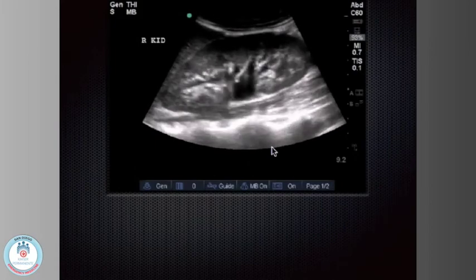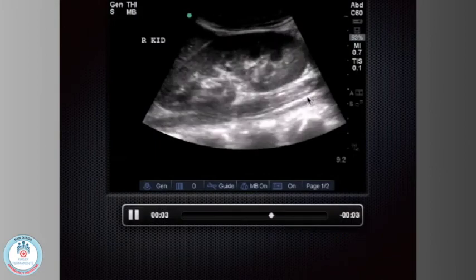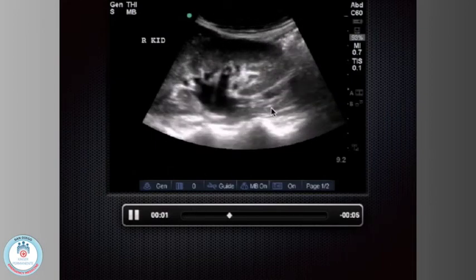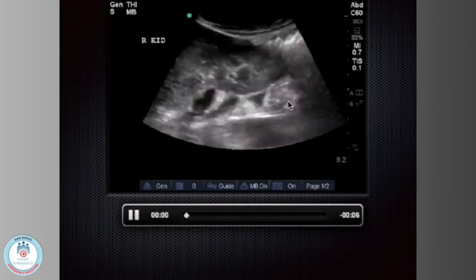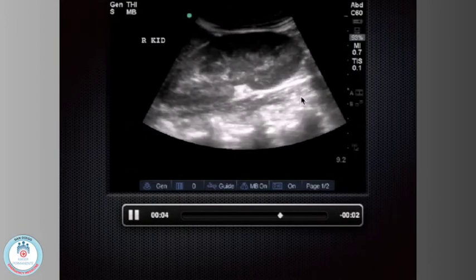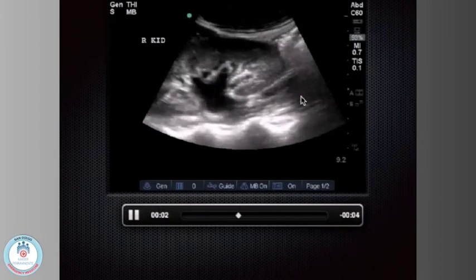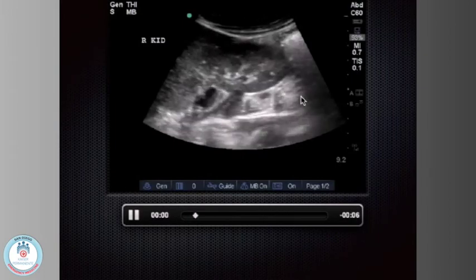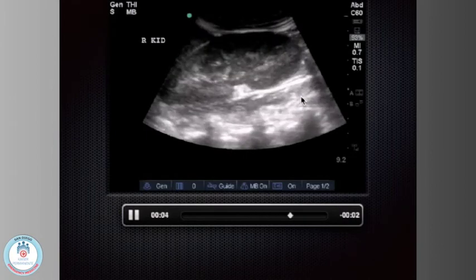Hydro. Good. And by the way, what muscle is this right here? The kidney sits on what muscle? Psoas. Yeah, I like to always remember that, because when I look for appendicitis, psoas is always on my mind, and then I start to notice these organs in other views. If you have the patient flex their leg, you'll see that muscle get thicker.